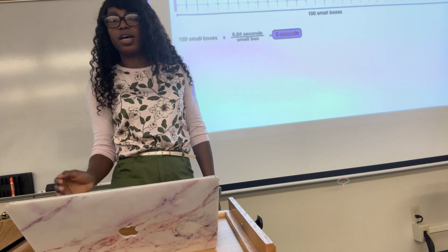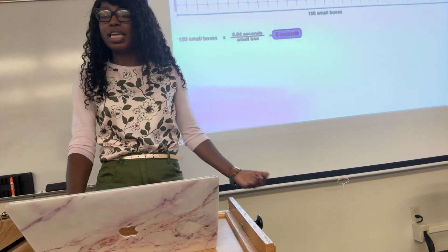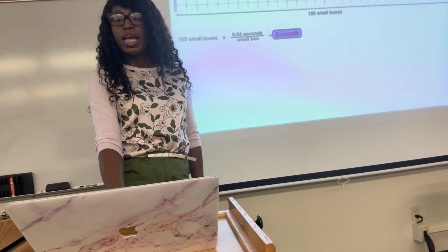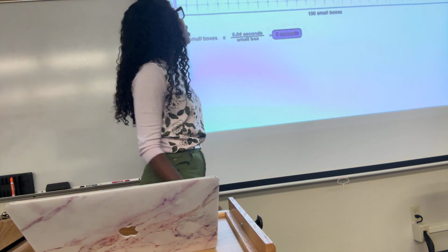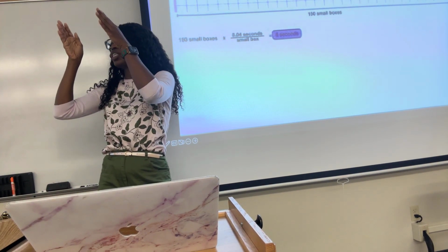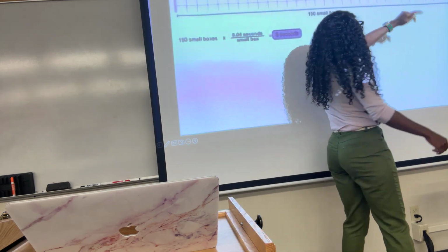And so for the irregular ones now, we use the 6-second rule, right? The 6-second method can be used with an irregular rhythm to estimate the rate. Look at the R to R peak intervals to see if they are the same or inconsistent. Count the number of R waves in a 6-second strip and then multiply by 10, right? Usually they calculate the 6-second strip, they rip it out, and all you have to do is count how many peaks you see, right? In this case, we see 1, 2, 3, 4, 5, 6, 7, 8, 9, 10.